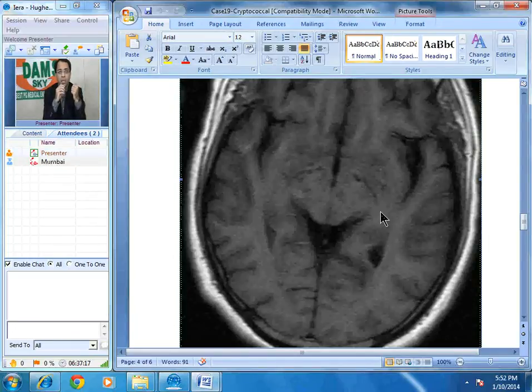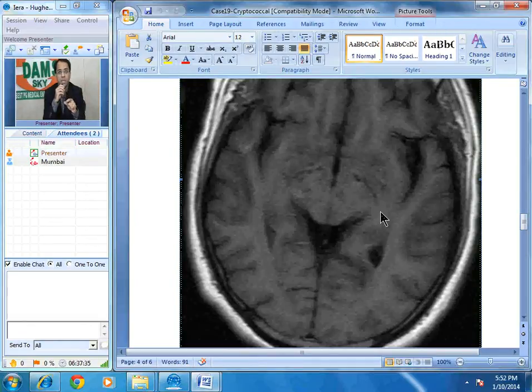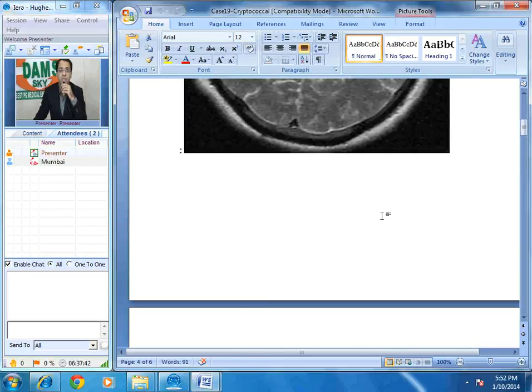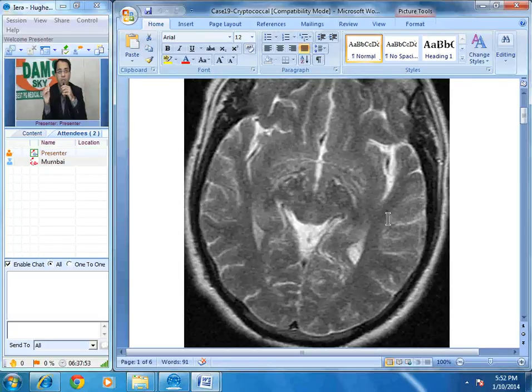Cryptococcal meningitis is a chronic meningitis in which you will see exudates in the basal cisterns. These gelatinous exudates spread via the perivascular spaces — also called Virchow-Robin spaces — into the brain stem and gangliocapsular region. This appearance of punctate T2 hyperintensities in the brain stem and gangliocapsular region, along with basal exudates, is characteristic of cryptococcal meningitis.